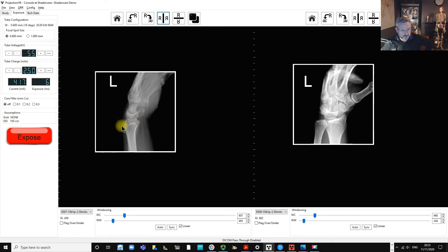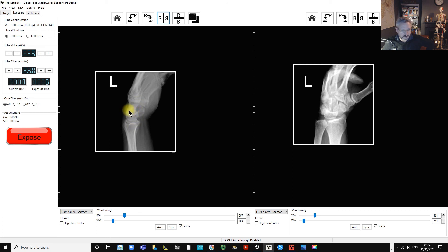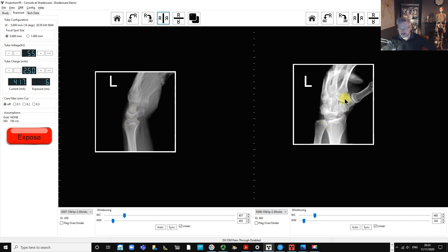On the lateral image we've got the ulnar styloid, the head of the ulna, and the radius pretty much superimposed. There's a nicely cup-shaped lunate, with the capitate sitting in the cup. The pisiform is visible anteriorly and the hook of the hamate is also seen. That gives us our complete scaphoid series — four projections covering all aspects of the scaphoid.